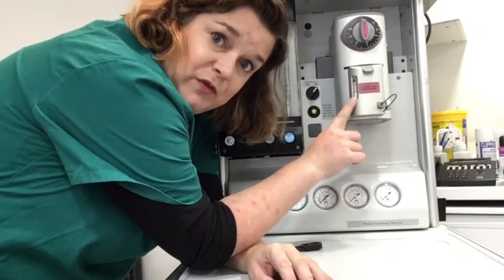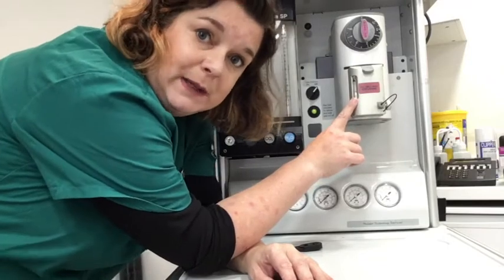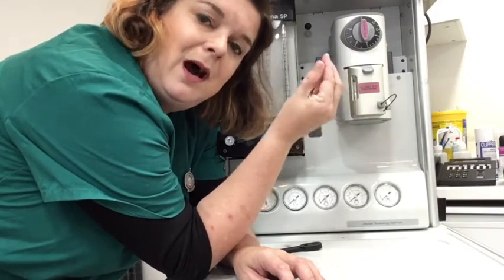In your exam centre, this will always be empty, because it's highly unlikely you'll be in an exam centre that has a licence to use gaseous anaesthetic. So you have to say what you see. Don't pretend — don't say it looks half full. It will be empty. Say it's empty, and then say what you would do. Because if you went into practice and it was empty, like it sometimes is, you would fill it up before the next procedure.